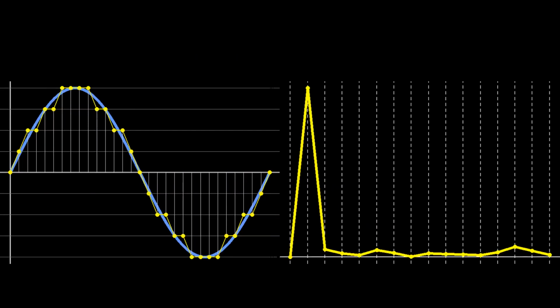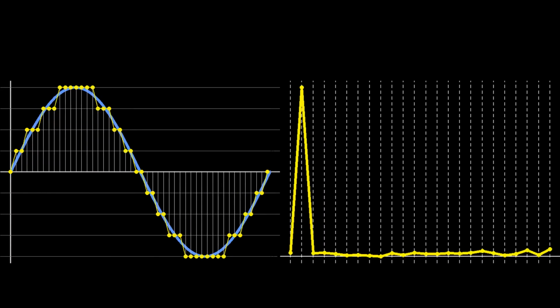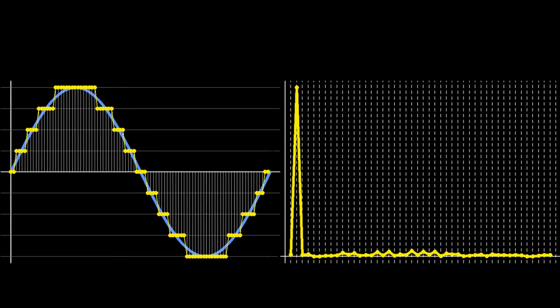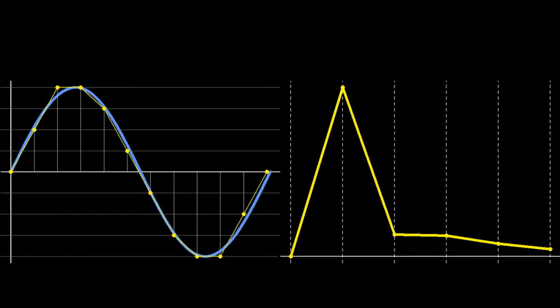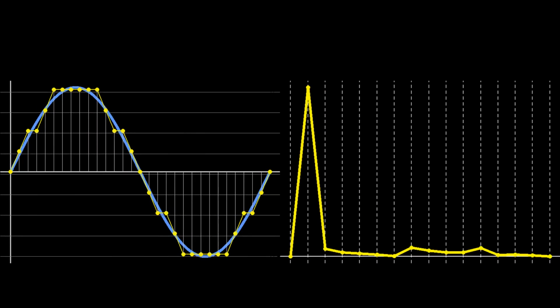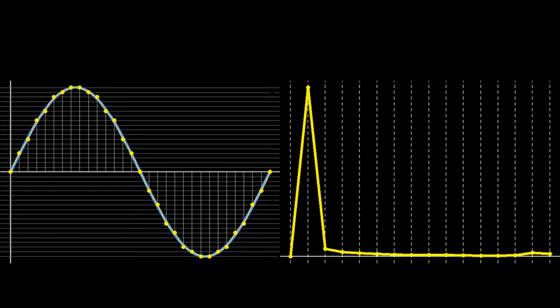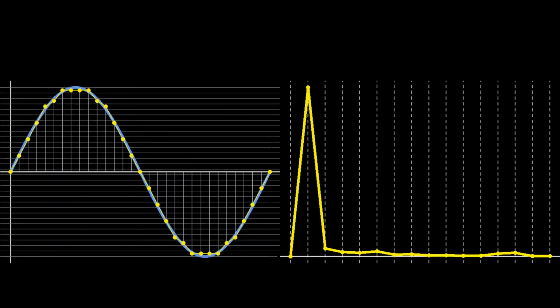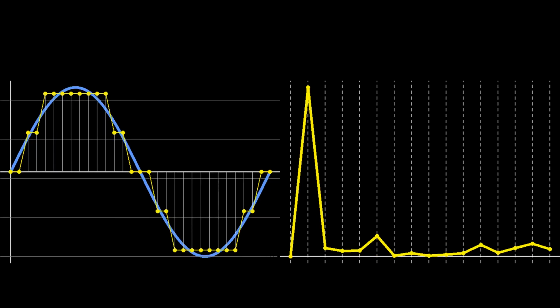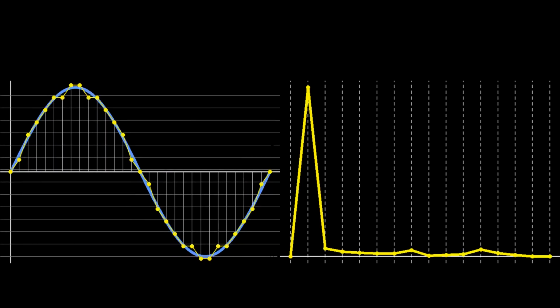Also, here's the same signal discretization plots from earlier but with their Fourier transforms. Increased sample rate. Notice that this expands our available frequencies in discrete Fourier space. Decreased sample rate. Increased bit depth. Decreased bit depth. Notice the effect the bit depth has on the Fourier space noise floor. And another aliasing animation.